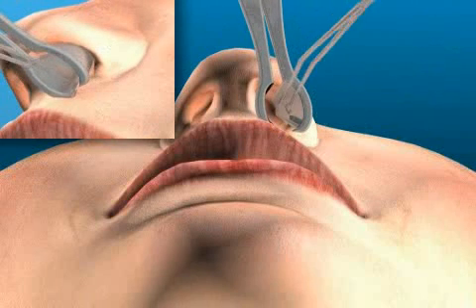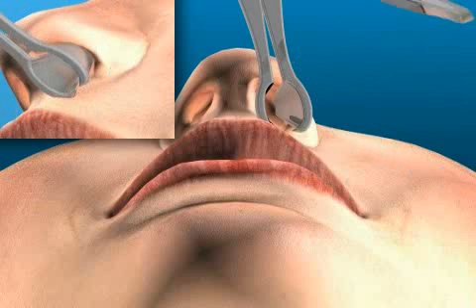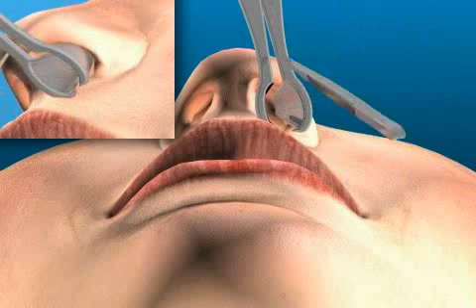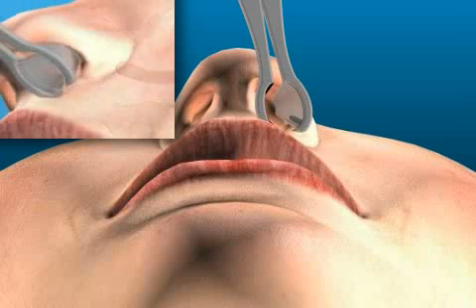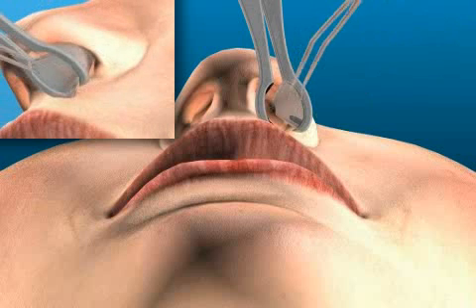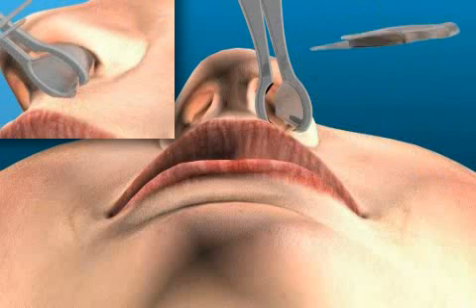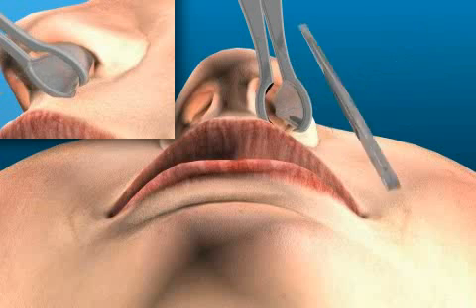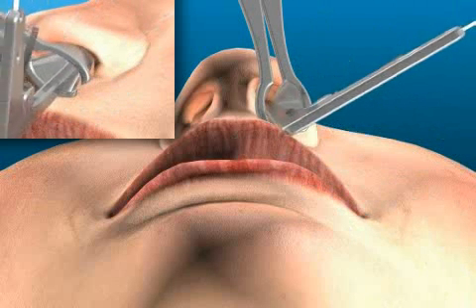Here you see a patient under general anesthetic. The surgery is a paranasal sinus restoration due to chronic paranasal sinus infection, resulting from a bad tooth-root treatment. The nose is spread out using the nasal speculum, and the small sinus access is widened with special instruments. Through the opening created, the sinuses can be flushed, and inflammatory material is removed.